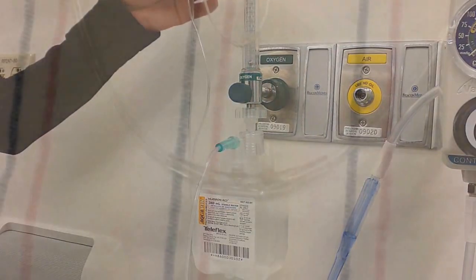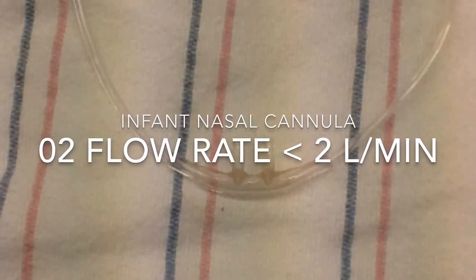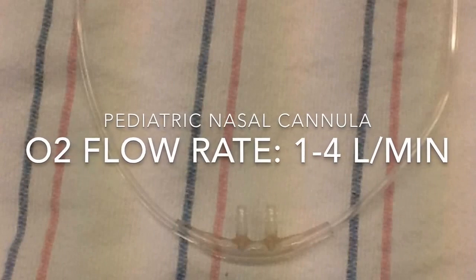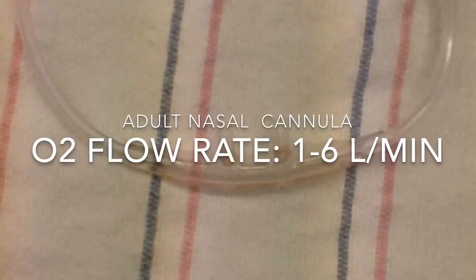This cannula comes in 3 different sizes: the infant, for which the flow should be maxed out at 2 liters, the pediatric, for which the flow should be set at 1 to 4, and the adult, for which the flow should be set at 1 to 6.